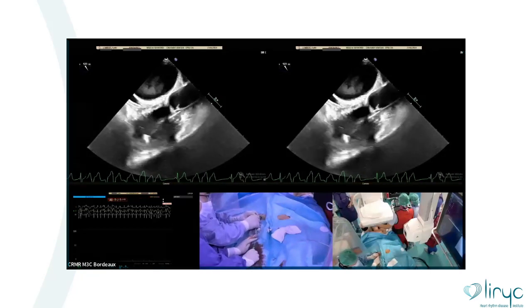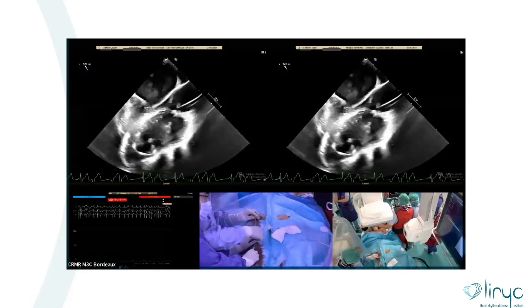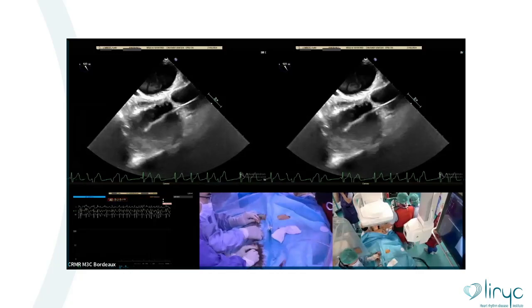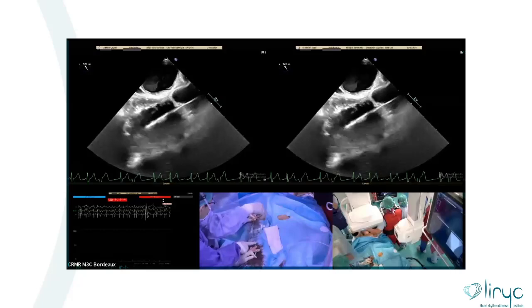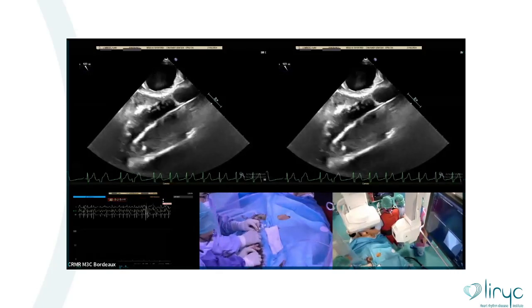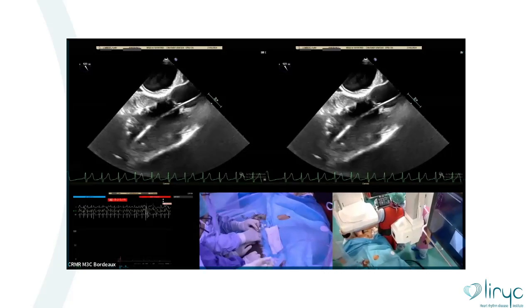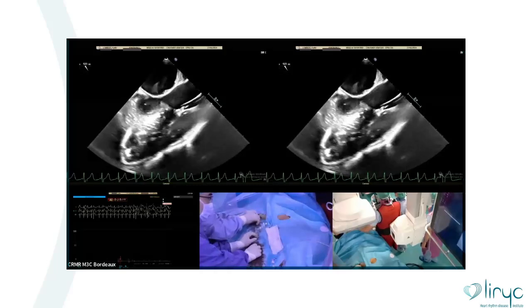So far. No, you haven't. Now it's done, but it's not enough. Okay, be careful. I think we're fine. Another key point is that if the VSD is small, don't get the inner curve out, because the sheath is not easy to pass. Okay, advance.